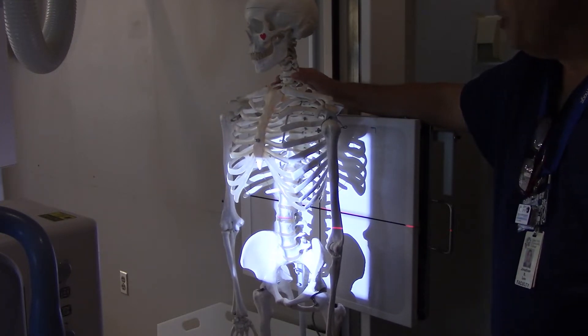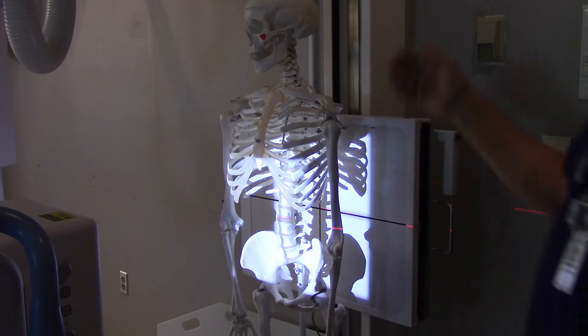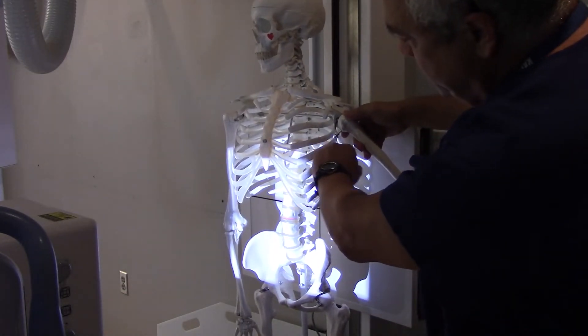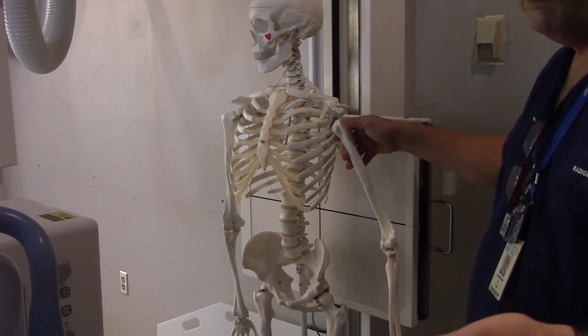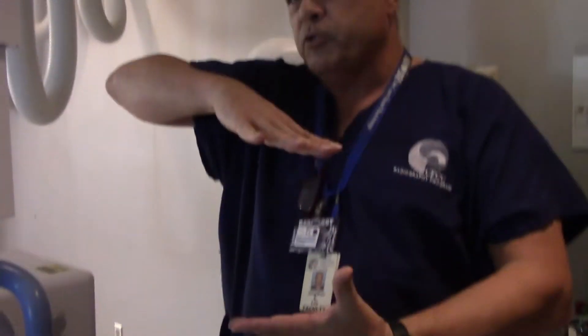We want to do this on expiration: take in a big deep breath, blow it all the way out, hold it out, hold still. One more thing — if the top of the light field is approximately at the level of the patient's axilla, then you know you're probably pretty well positioned for this x-ray. If your patient is wide, you might want to do two x-rays — one crosswise to get the diaphragms and another crosswise to get the inferior anatomy.